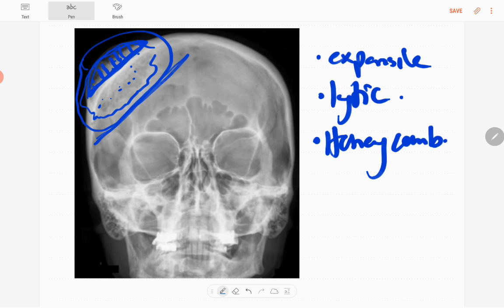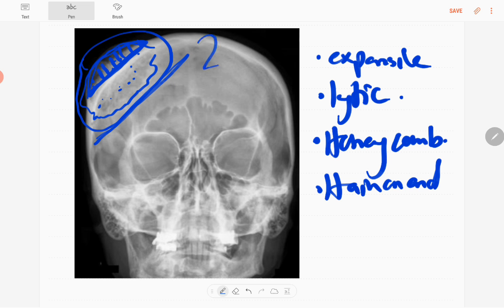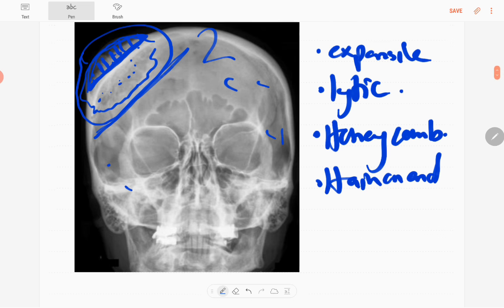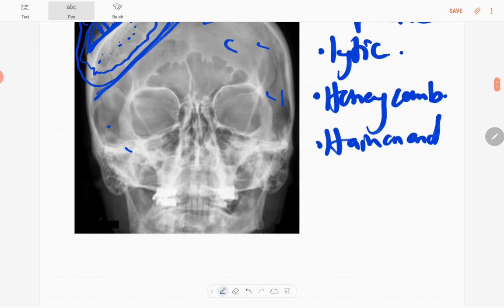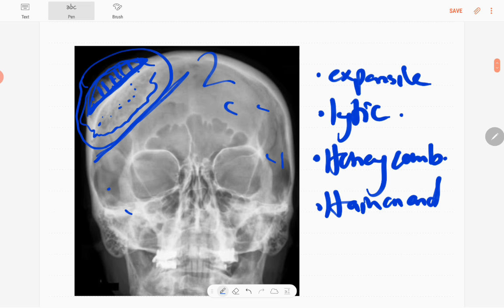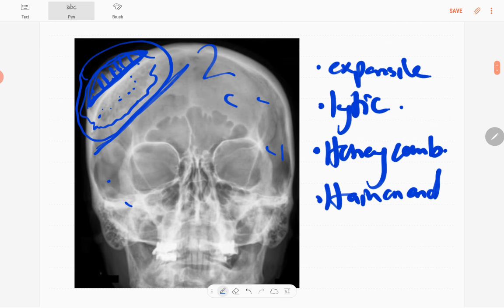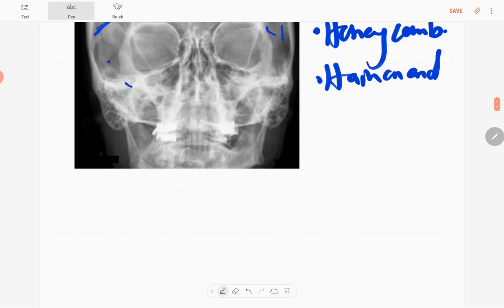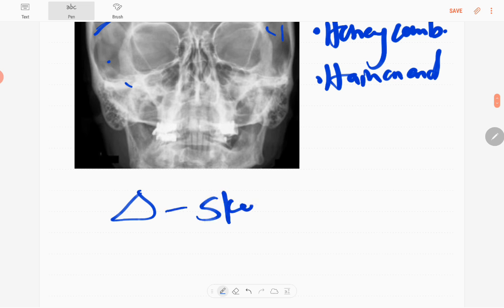It doesn't have a soft tissue component and no synchronous lesions as well. The rest of the skull bones are normal. In this case, there's also no periosteal reaction. So the diagnosis of this x-ray is skull vault hemangioma.